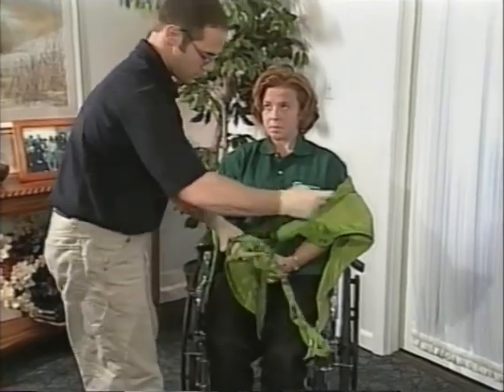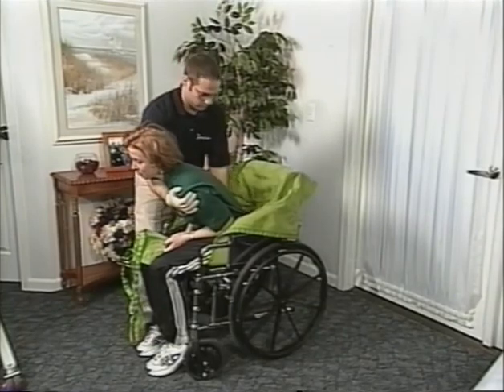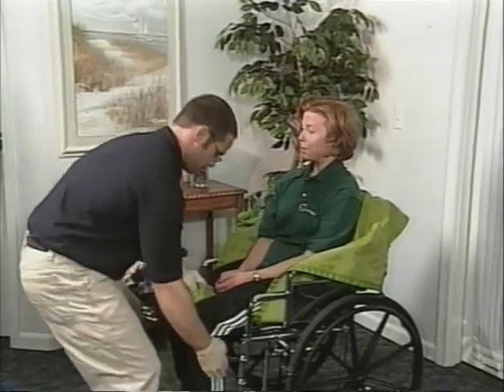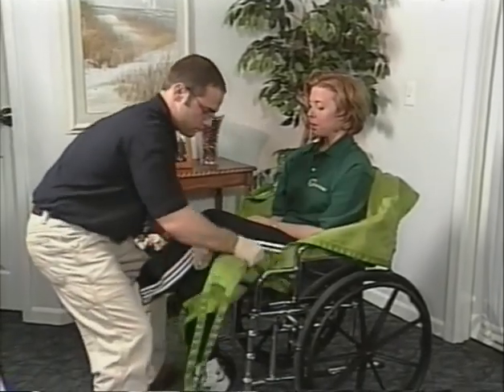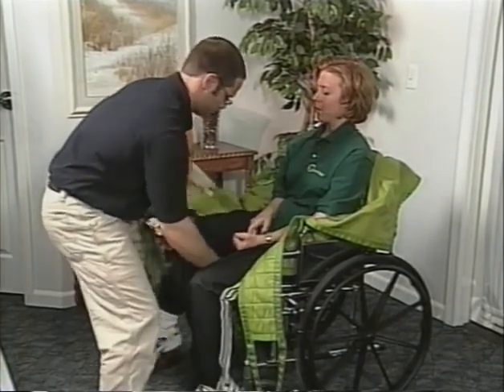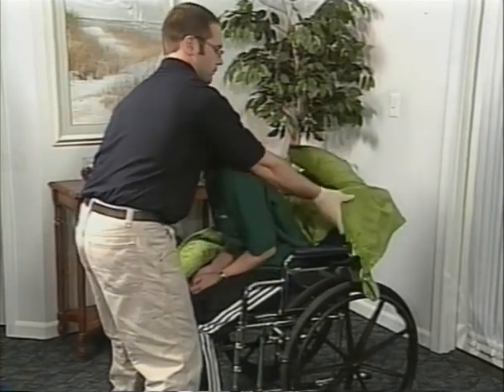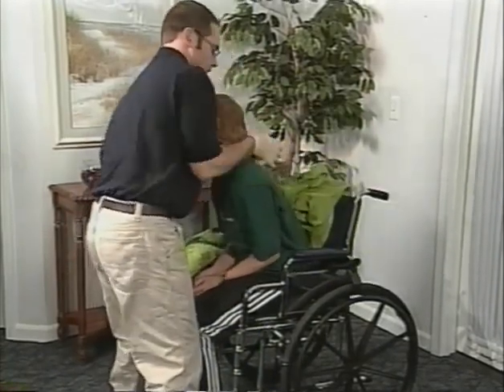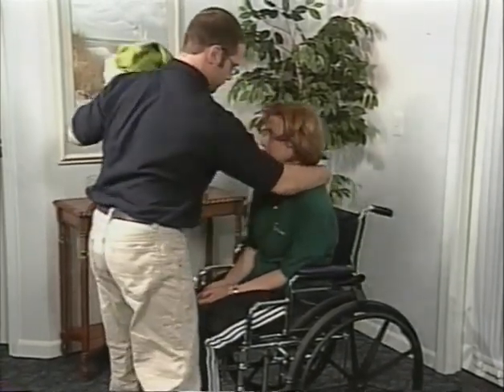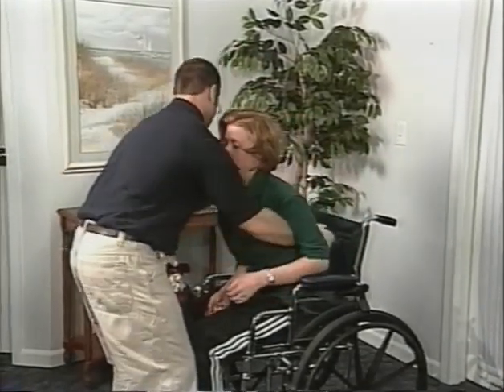Be sure the client is all the way back in the chair using the previous technique. Remove the sling straps from under the client's legs and position them on the client's sides, or remove the entire sling. Position the client in the chair as previously demonstrated.